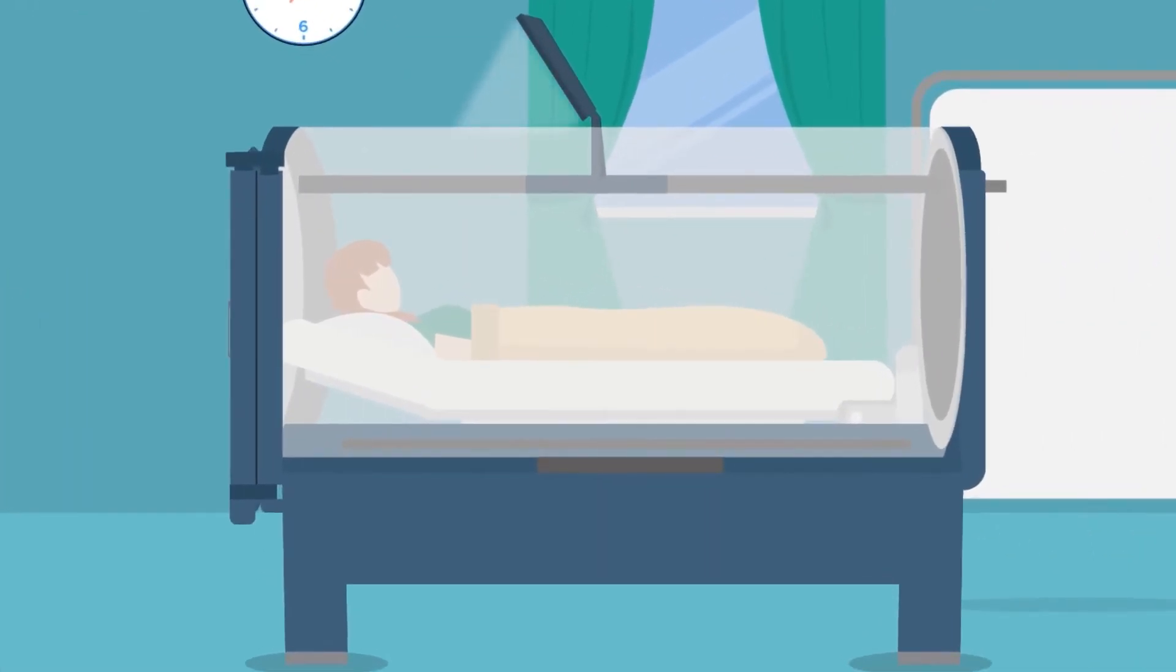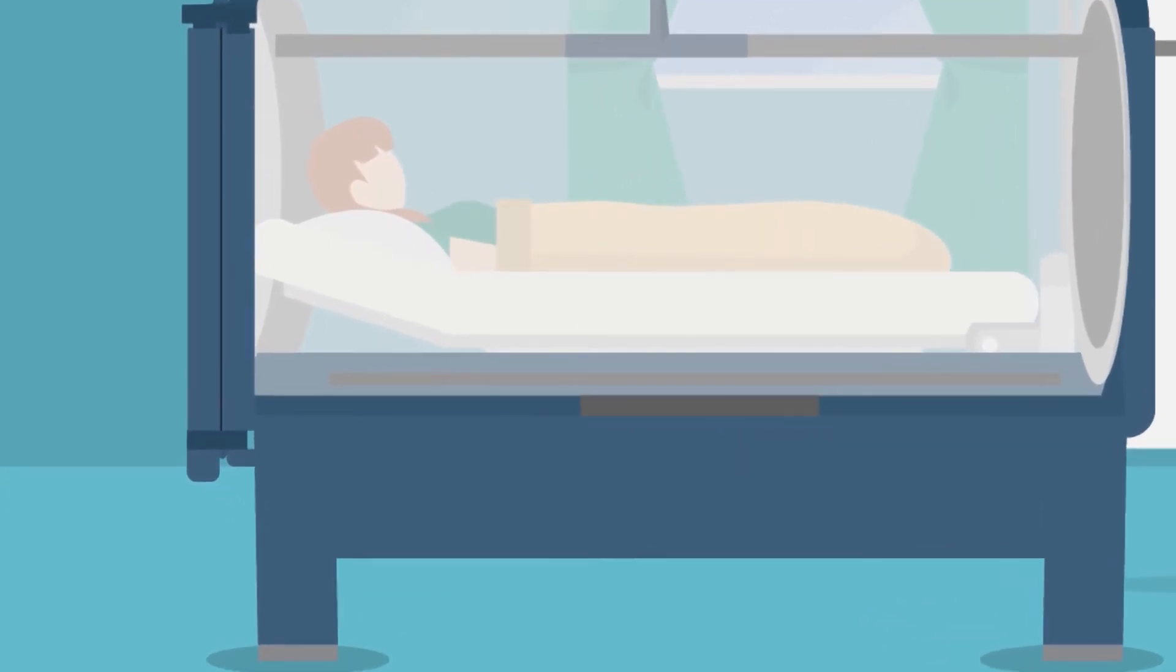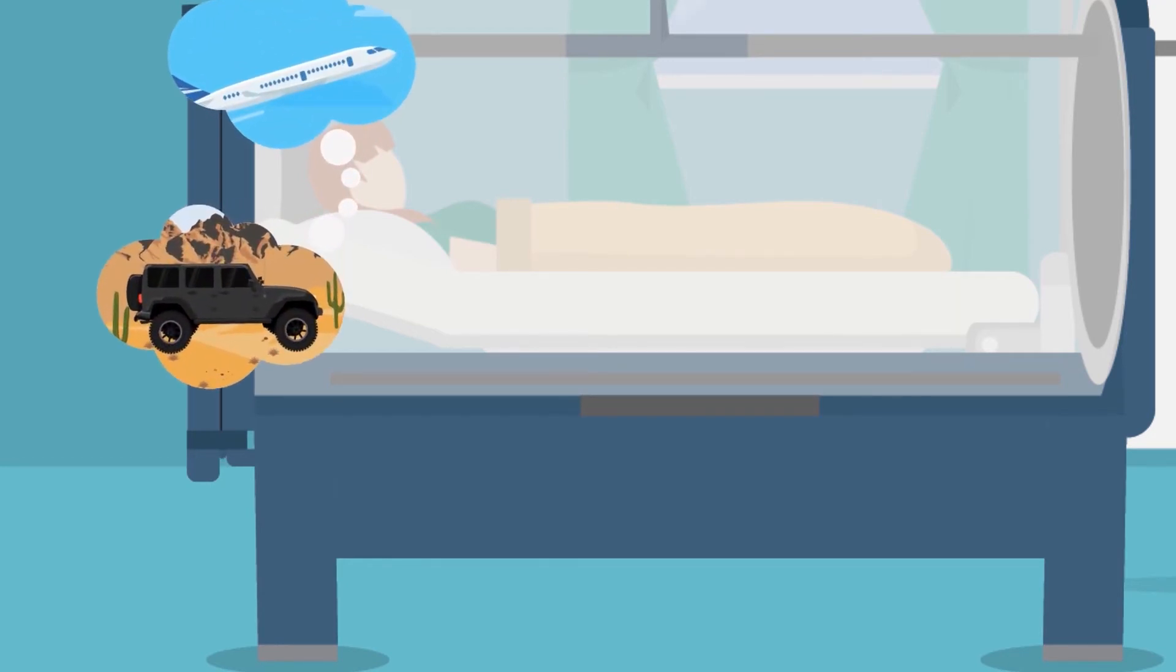Once the doors to the hyperbaric chamber are closed, you will hear the oxygen begin to circulate as the pressure gradually increases. This is called compression. You may feel a fullness or popping sensation in your ears, just like flying in a plane or driving in the mountains. This is due to the increasing pressure inside the chamber.